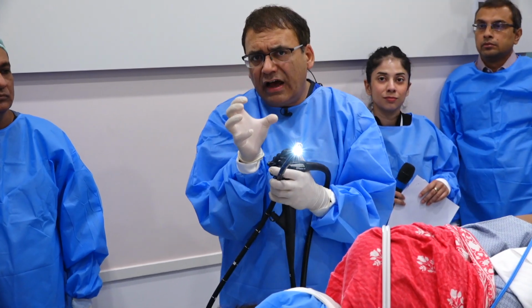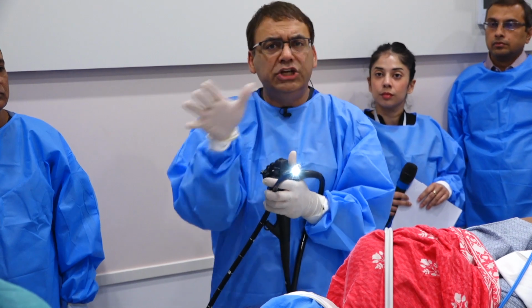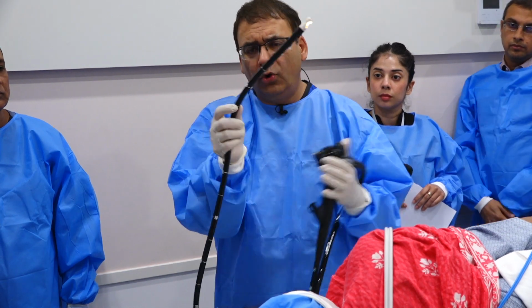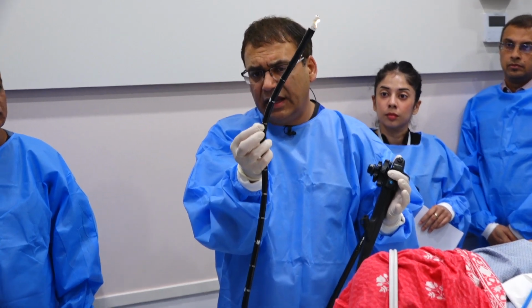Also, the upper esophageal sphincter in the majority of patients is going to be from 15 to 19 centimeters from the incisors, based on their height. So what I do is I hold the scope close to 25 or between 25 and 30.